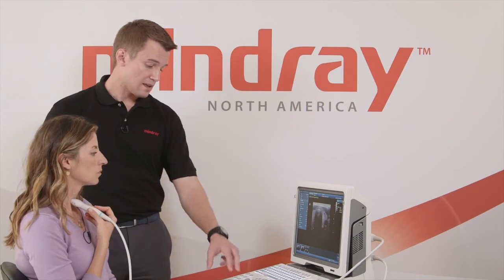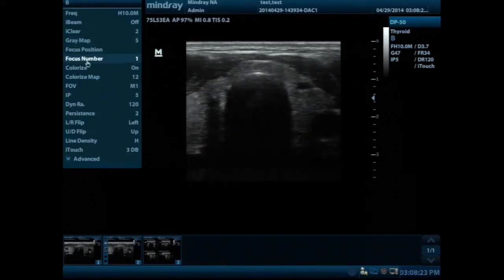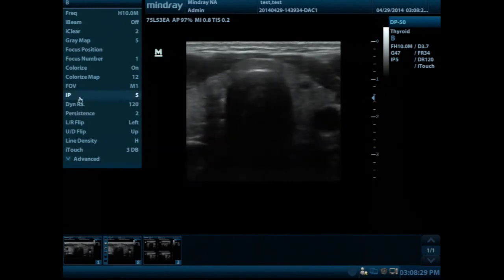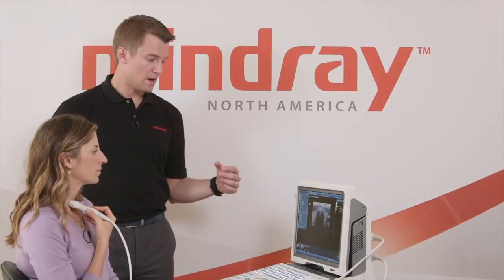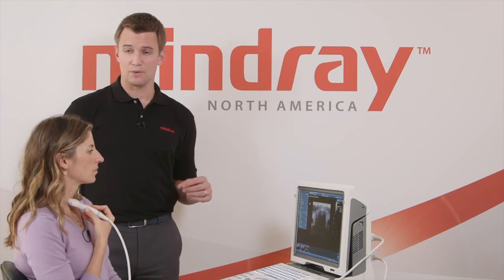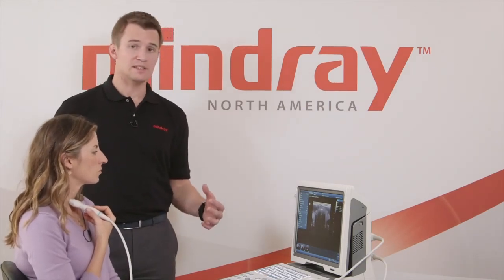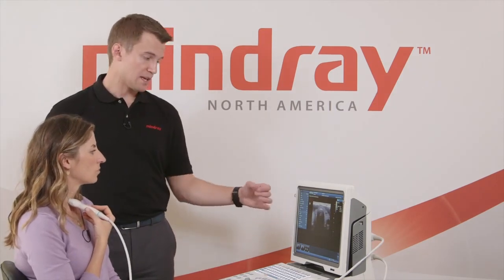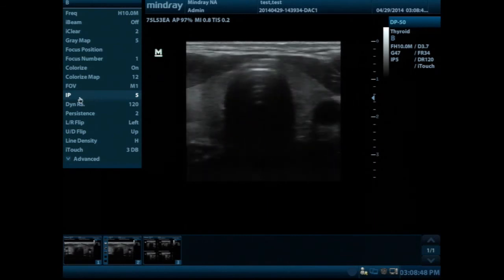So when you're scanning, it's good to play with the gray maps and maybe the dynamic range, which will change the level of brightness and grays. If you have a low dynamic range, it's really grainy and crisp and bright. Whereas if you take the dynamic range higher, what you'll find is it's more smoothed out, with lots of gray. Each exam preset will be set to a different dynamic range, as well as gray maps. Those are things that you just want to manipulate and see what you prefer as you're looking at them.